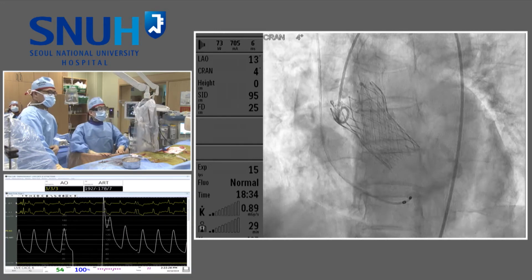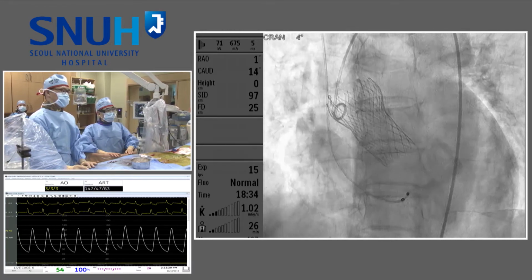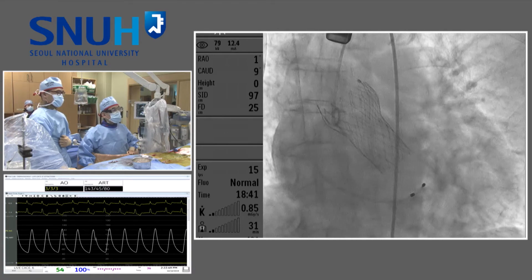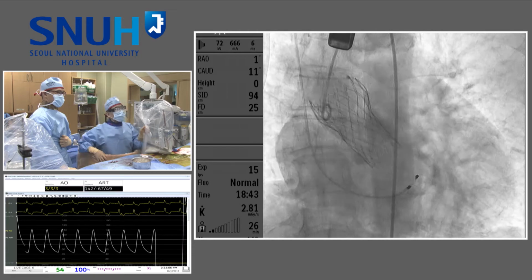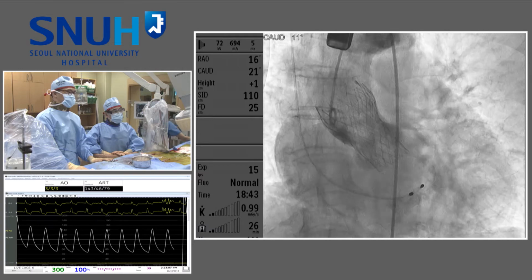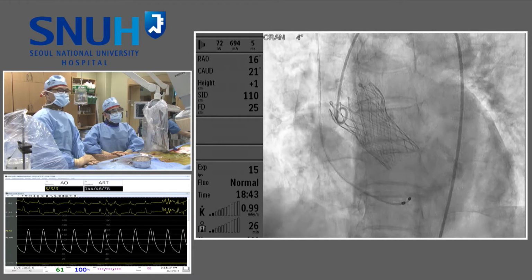I think that the PVL is definitely no more than mild, and the question now is whether you should post-dilate with a mild dilatation. Now, I'll be honest with you, there is no true answer for this, in my opinion, except my ego. And usually, I'm saying all the time that we are, after those times that we are giving up, not post-dilating mild. I think that in this case, it's not even mild. Have a look. From one injection to the other, it disappears completely, which is one of the advantages of the Pro with the outer skirt. So I think that in this case, I would not post-dilate.